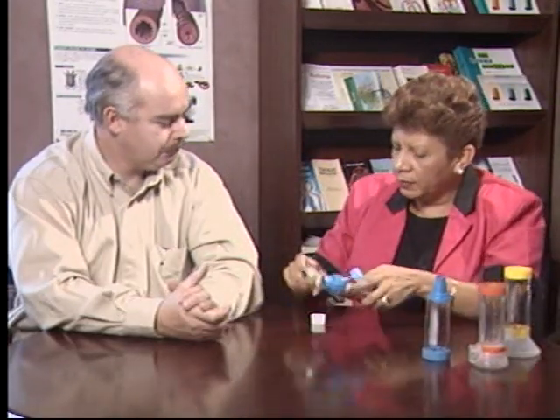Okay, now I'm going to do it. So number one, take the caps off, shake it, put it together, and then blow.